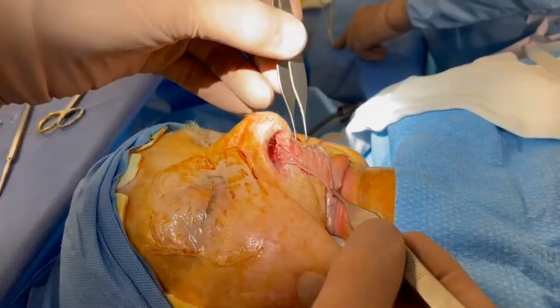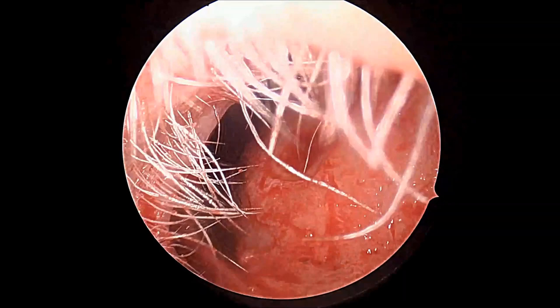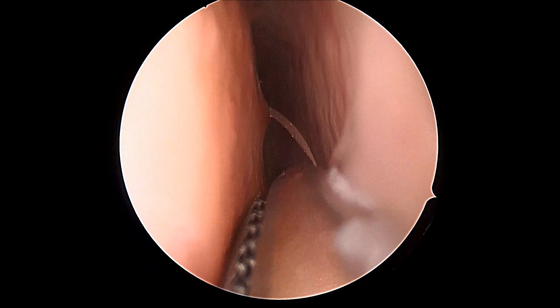The graft, with its raw surface up, is folded in into the nasal passage, and then carefully folded out so as to ensure that the correct side is up and there is no folding in of the edges. Once it's been unfolded and covers the defect nicely, and any adjustments made for size, a vicryl rapide suture is placed at the very top to prevent it from sagging down.